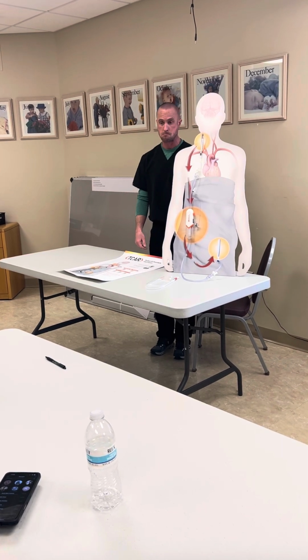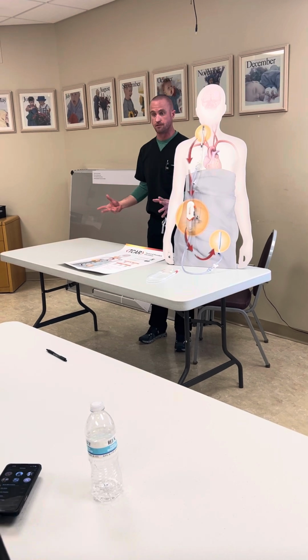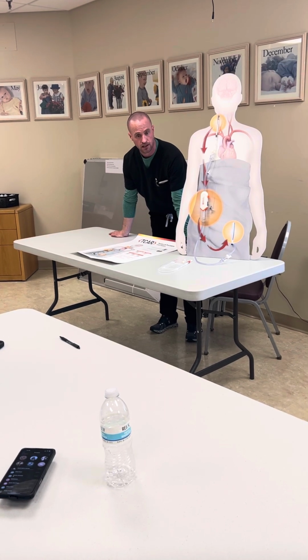And we can do the A-line on either side, whichever is closest to the machine, as long as they're not some kind of subclavian issue. Which we usually look at too, if I have imaging that shows me.